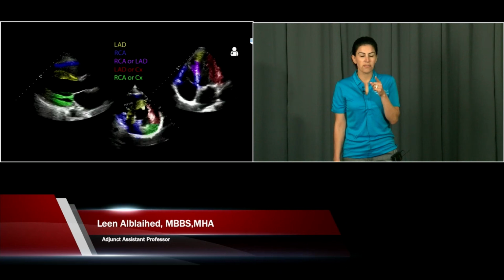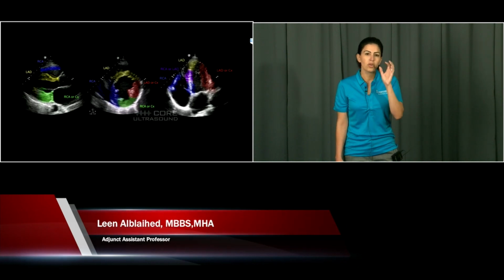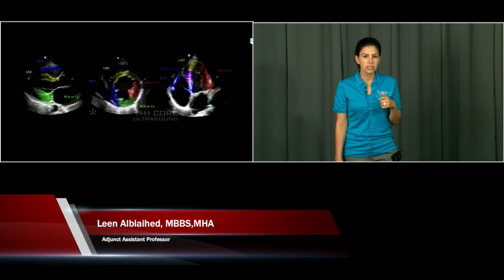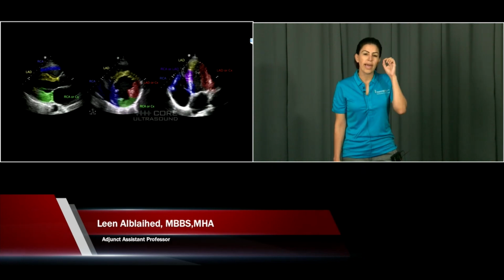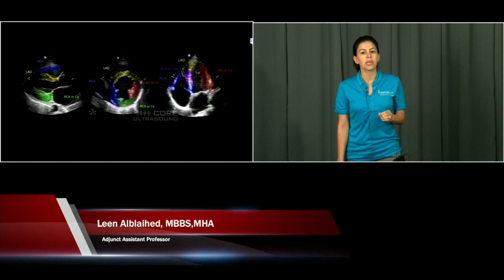I have this on my phone as a reference. You guys have a copy of the slides. You can take this. It just helps you kind of know which vessel corresponds to what. But as long as you diagnose the thickening and thinning, you should be good. And if you call your cardiologist saying, hey, this is new, her last echo was normal, or the patient never had an MI, and now I actually see wall motion abnormality, that is concerning for ischemia.